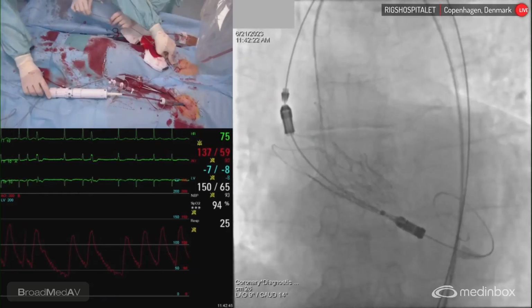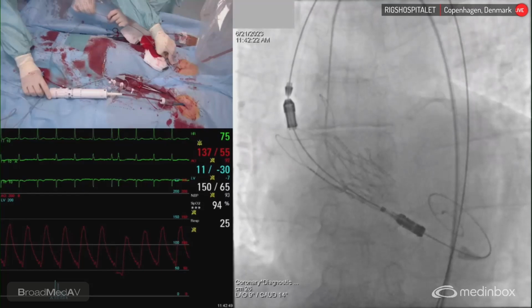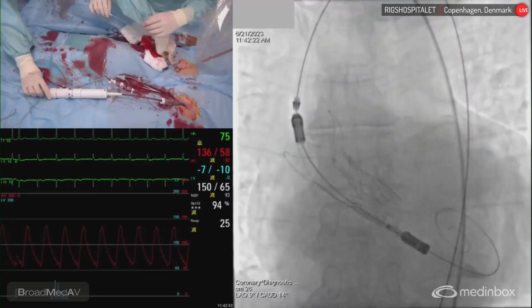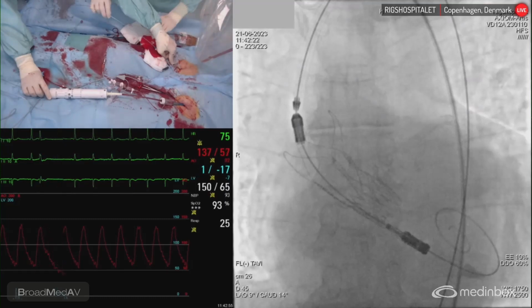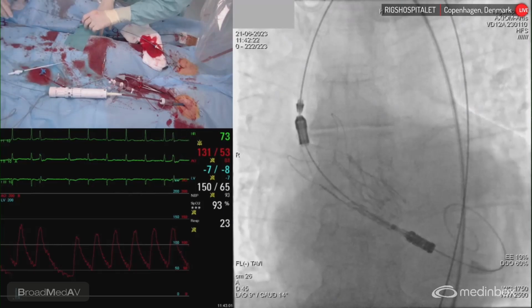Oh, we have to be careful. Careful. Yep. And the wire is just so. Yeah. All right. That's good. That's fine. So what we're gonna do is we're gonna take, but maybe that's the safety wire. Then we have to drop that idea for now, I think.